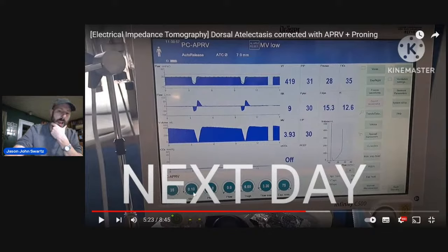Here, when you add a slope, so ideally don't add a slope. You want really 75% of peak expiratory flow to terminate and to go back up. If you add a slope, you're going to notice an increase in the tidal volume. So in APRV, when you see the tidal volume, when they're not breathing, obviously it's measuring the drop here. Okay, the difference.